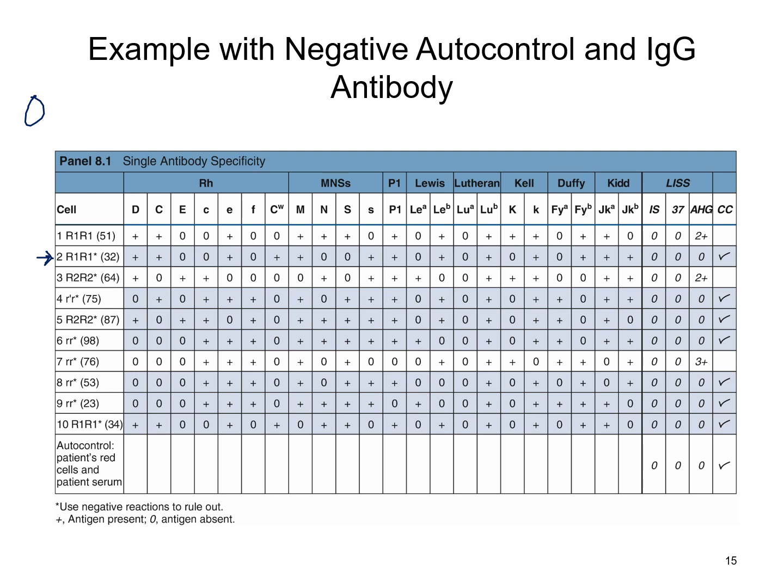Now this is my particular way that I do a rule-out. Everyone does them a little bit different as far as how they indicate they've done the rule-out. But the way I like to do it is I like to actually mark on the panel cell itself where I did my rule-out. So for example, I'm ruling out D on cell number 2, and then I come across the top and I also rule it out. All right, let's move over to our next.